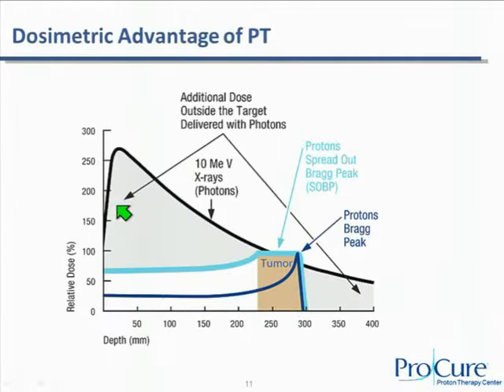So what are the beam characteristics at depth? You've seen this everywhere. You've got a one-dimensional comparison here of photons versus protons, and you can see that if we're going to cover a hypothetical tumor size at that depth, you can do it with a single spread-out Bragg peak. But with photons, if you normalize at the tumor center, you'll get this kind of distribution, indicating that the photons go right through the tumor and deposit significant, unneeded dose before and after it in healthy tissue.